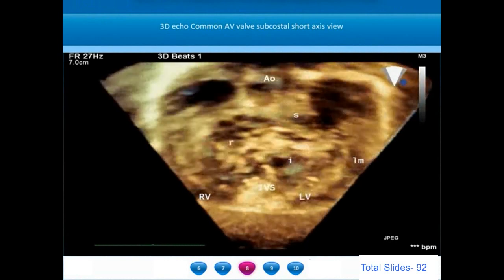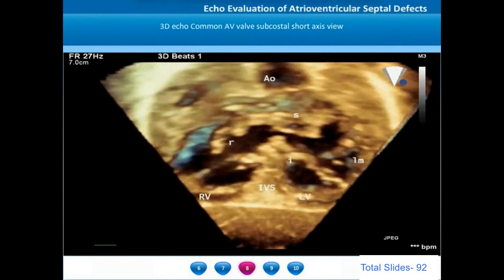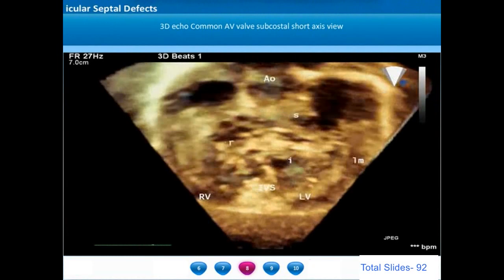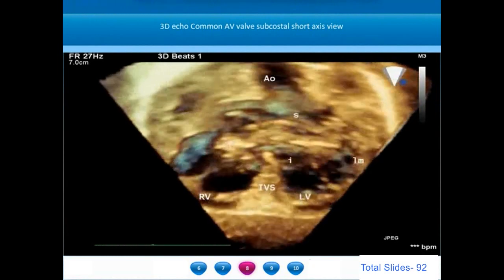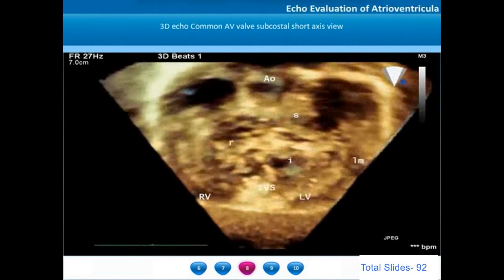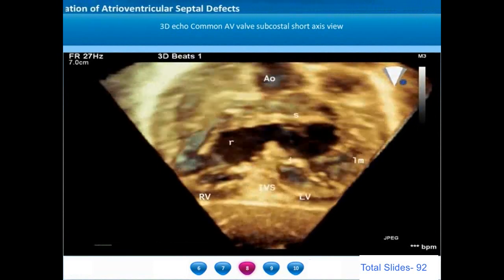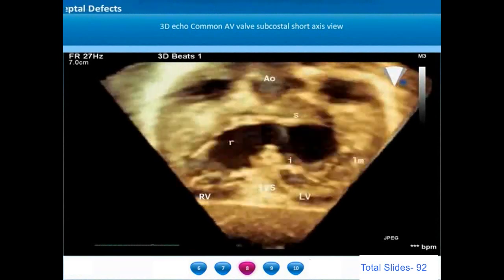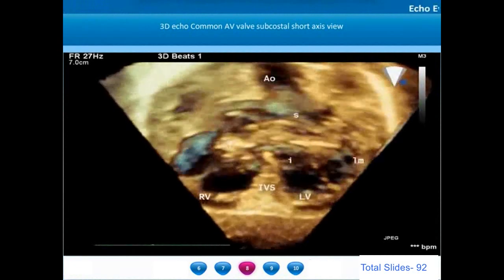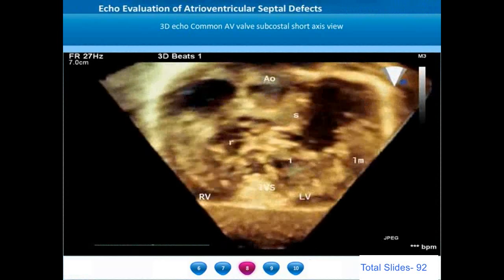On the short axis view of the AV valve ring, we can appreciate the superior and inferior bridging leaflets and the left mural leaflets. The commissures that separate the right-sided leaflets from the bridging leaflets have commissural cordae that attach to the crest of the interventricular septum. The superior and inferior bridging leaflets are mostly confined to the region of the left ventricle — a feature of Rastelli type A, which is the most common type of atrioventricular valve.